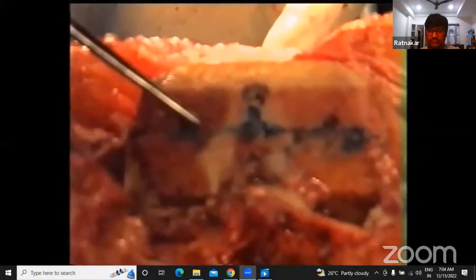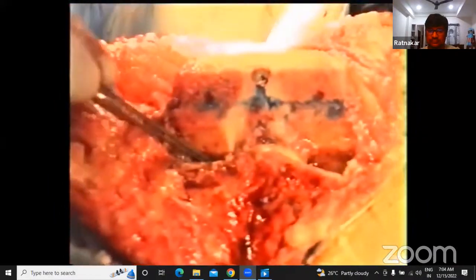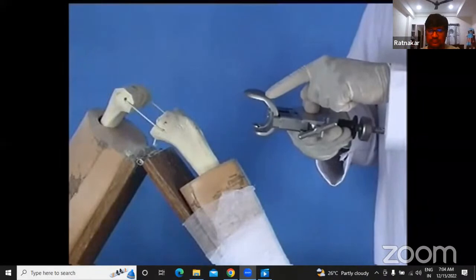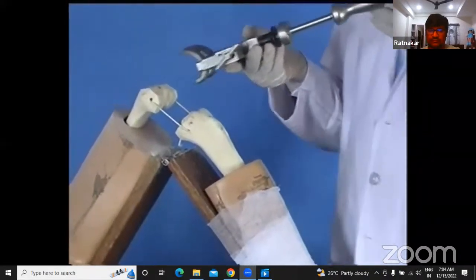Now our femoral cuts are finished. That is the anterior cut. That is the anterior chamfer. That is the distal cut. That is the posterior chamfer. And that is the posterior cut. I have loaded the femoral component onto the femoral holder, and now let's go and see.